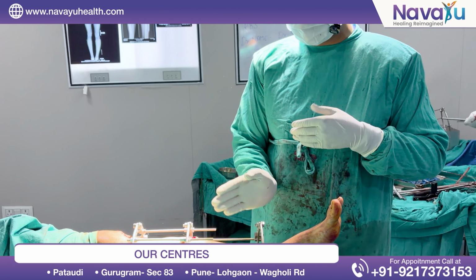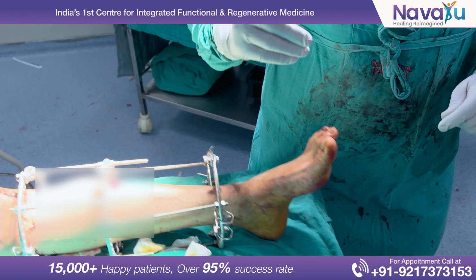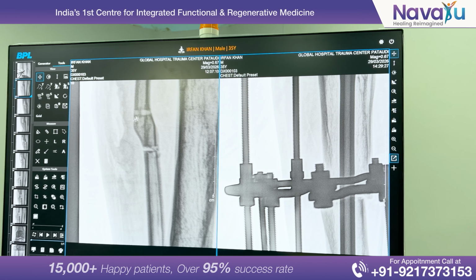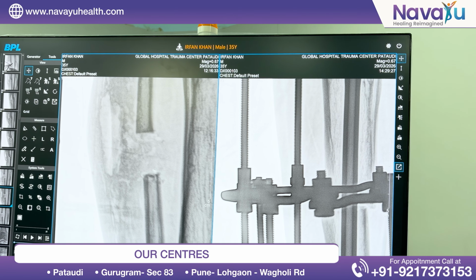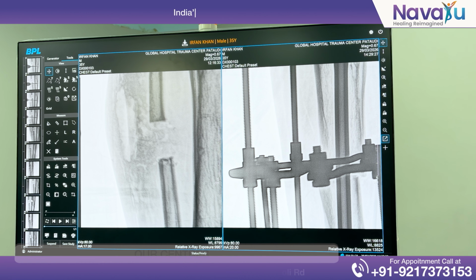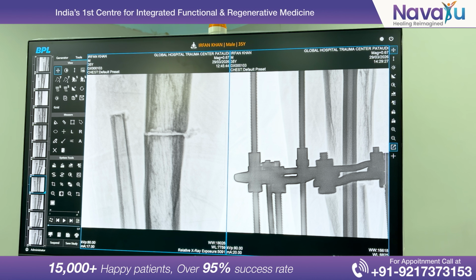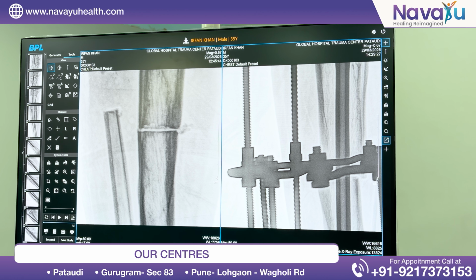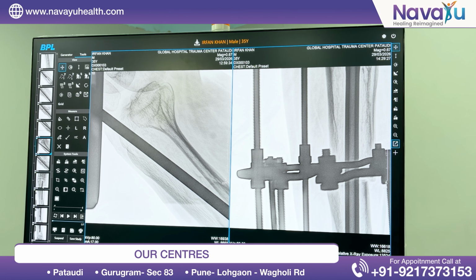Now you can see the limb is totally straight, and we have put the nail also. I will just show you. So this was the fibula. We needed to cut this fibula because it was deformed, and this is after fibula cutting. We have removed almost 1.5 centimeter of fibula because it was totally deformed. This is the osteotomy which we have made in the tibia to correct the deformity. Once after correction of deformity, we introduced our nail. This is the point of entry of the nail, and we were very comfortably able to insert the nail.